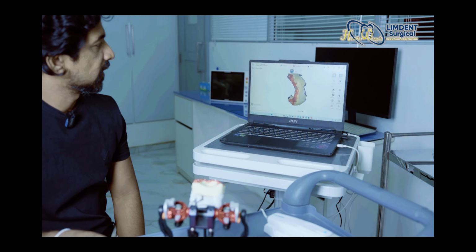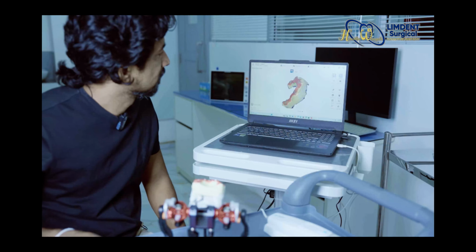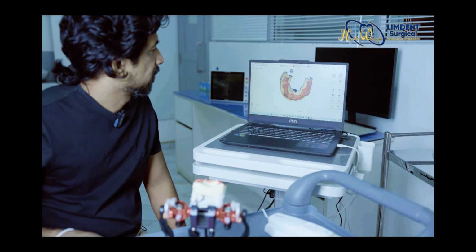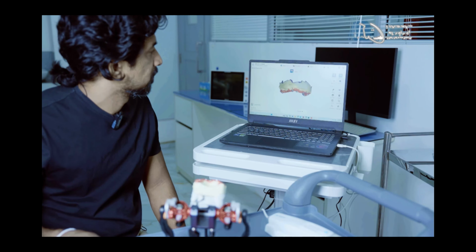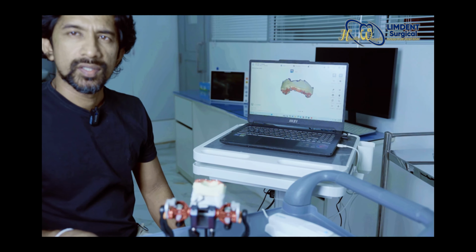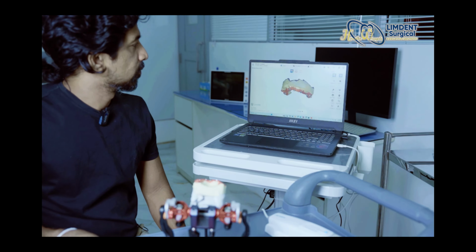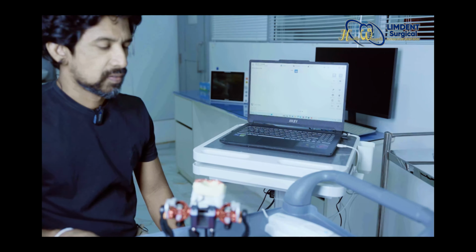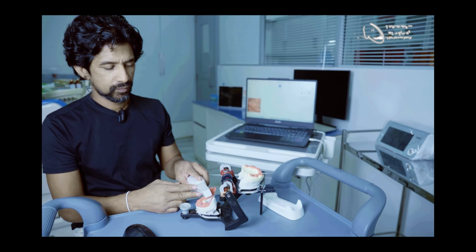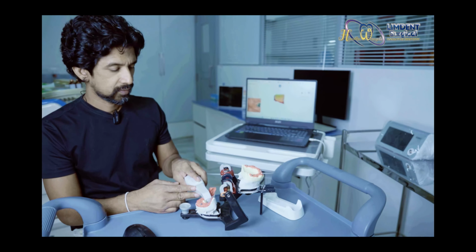I can go ahead and check whether you got the proper data of the upper arch for us to proceed with the virtual bite registration. Now we'll move on to the lower cast. We'll be starting to record the impression surface of the implant bed.